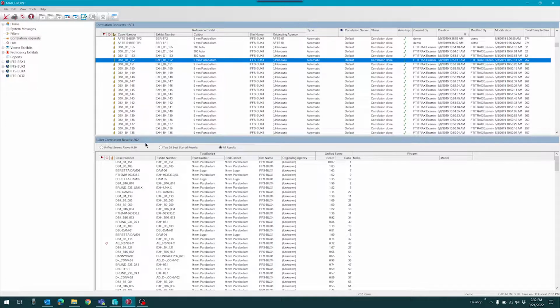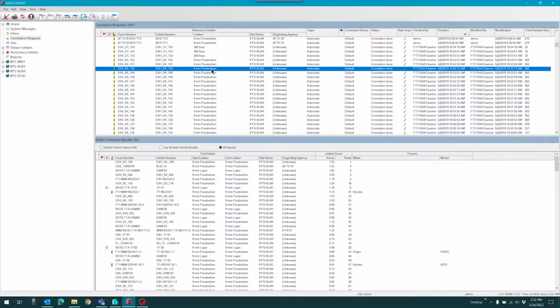Over time though, your IBIS database is only going to get bigger and bigger, and eventually you're going to get into the thousands and tens of thousands with the number of results coming back. And every time you make a selection here, if you're looking at all the results and it's got to number crunch 10,000 results, that is going to start building up a lot of time. Each time you click on one of these, you're going to have to wait 2 minutes or 5 minutes or what have you. So it's good to preset one of these two filters on the front here.